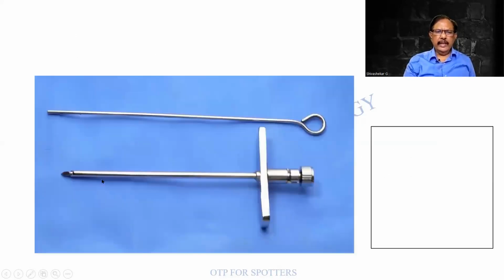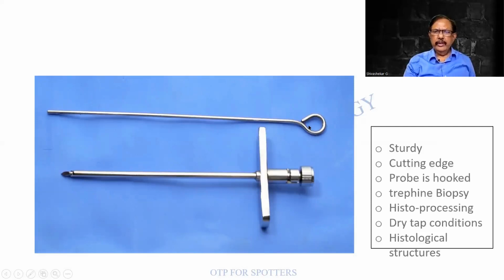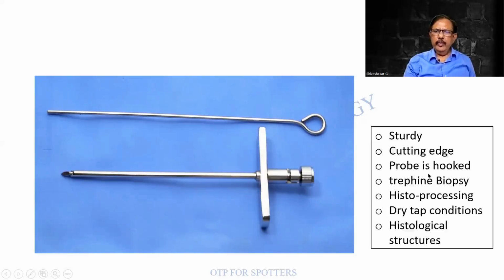This is yet another needle. This is also long as well as stout. It has got a cutting edge, and this has got a stylet. It has got a hooklet at the end. So the sturdy probe is hooked.